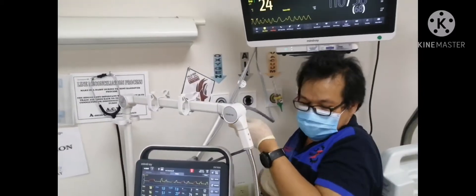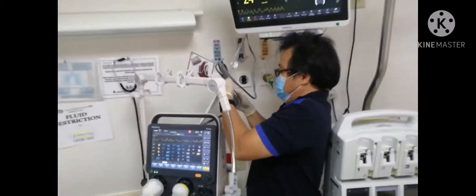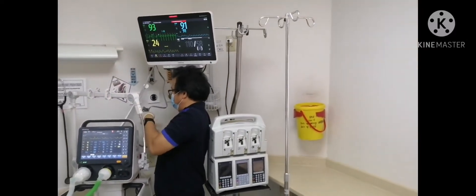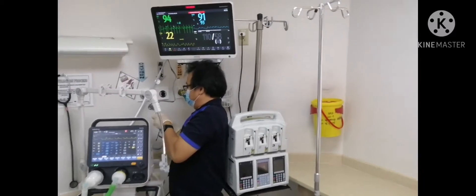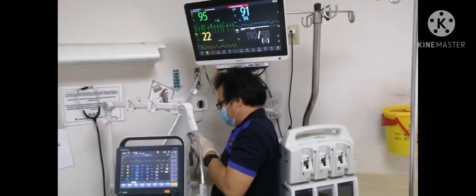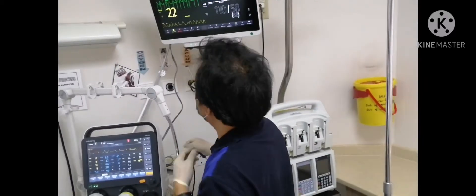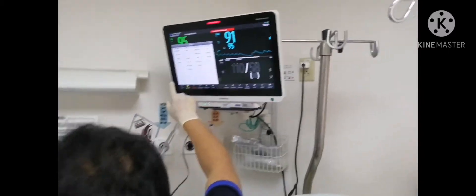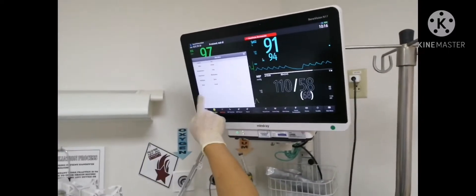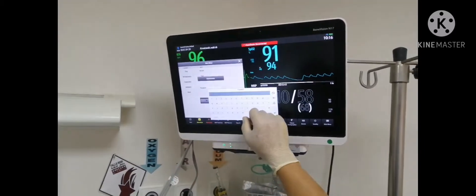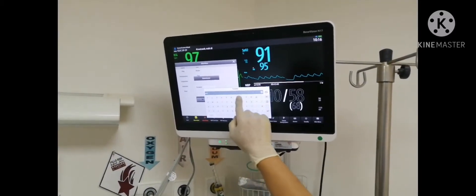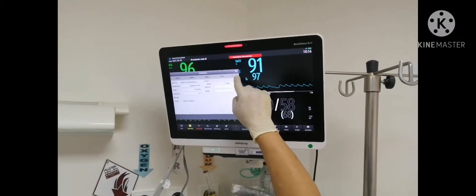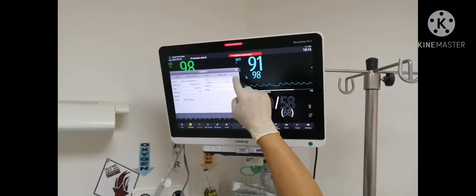Where is the cable? Don't take the patient out. This is for settings. Yeah, settings.